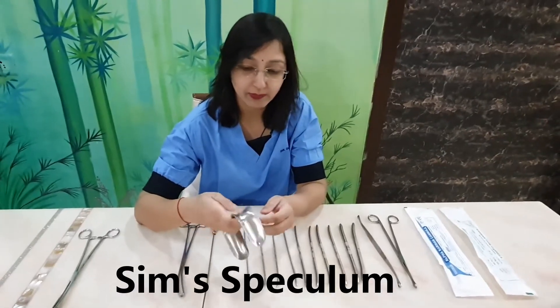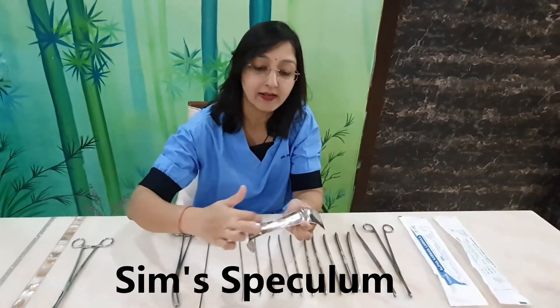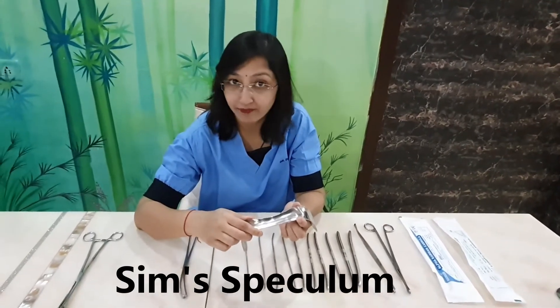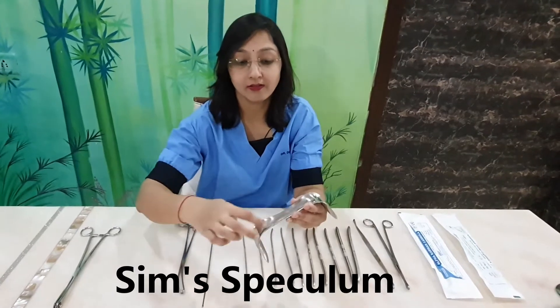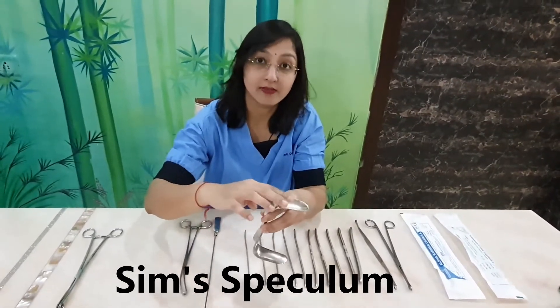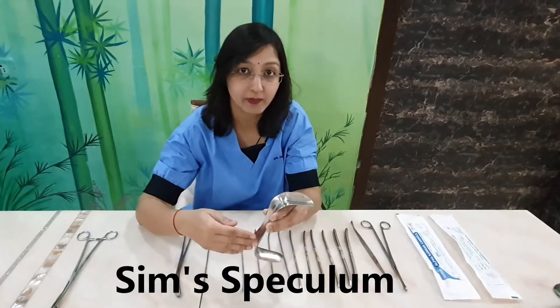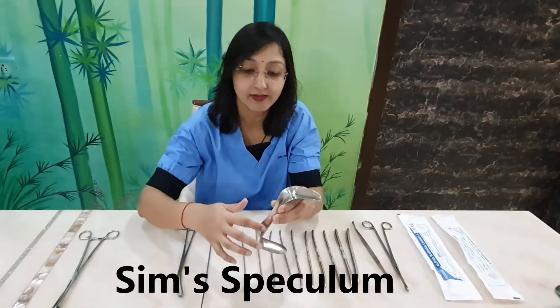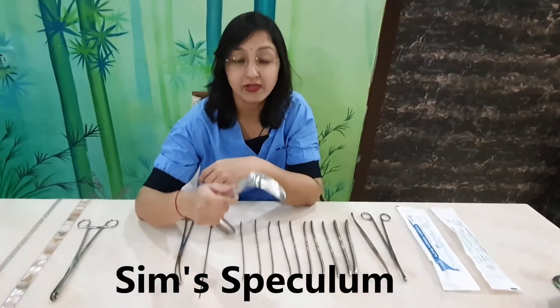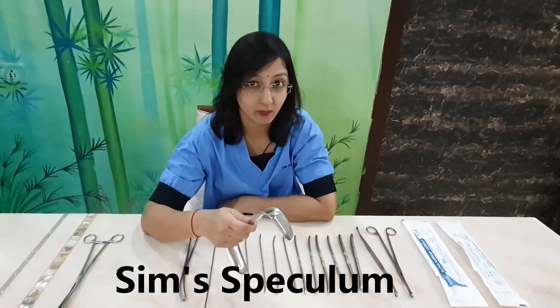The mid part — the handle of the Sims speculum — has a curvature. This curvature is to prevent any injury or lacerations to the vagina. You can also see an indentation or depth in the handle; this allows liquid to dribble through and not spill over. Essentially, the Sims speculum is used to retract or depress the posterior vaginal wall.